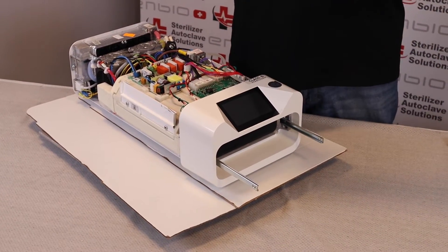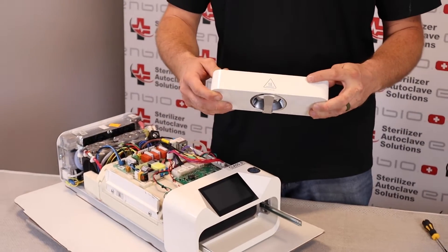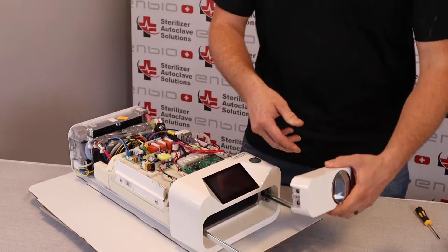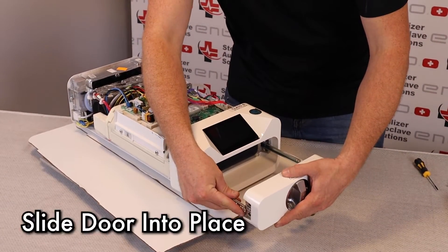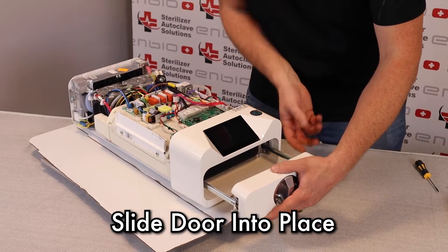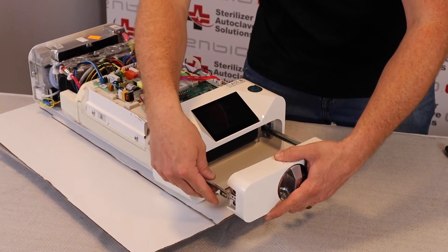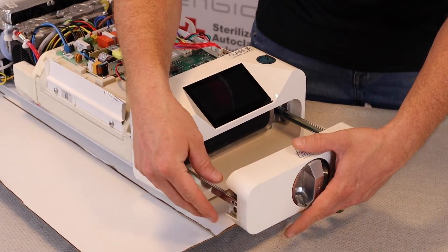This door has two different sides. There is a top, which has hot surface, and a bottom, which has two screws. So with the top up, we're just going to slide the door back into place. And once these are in place, the door will actually just sit there.